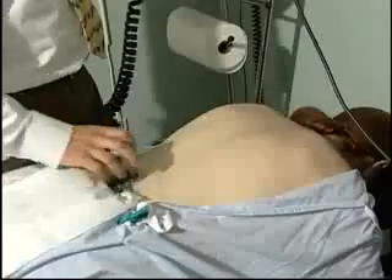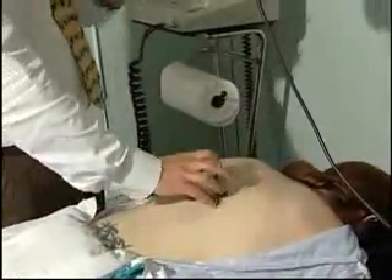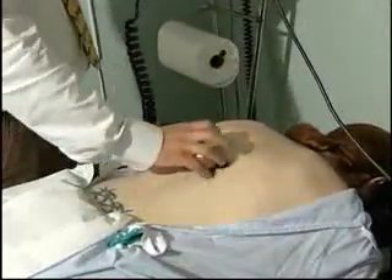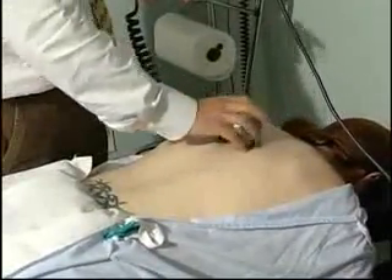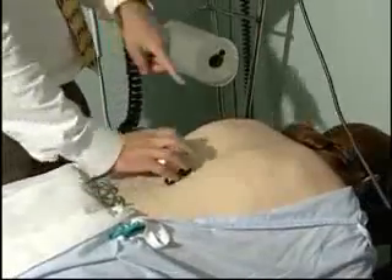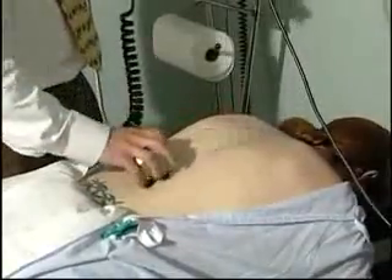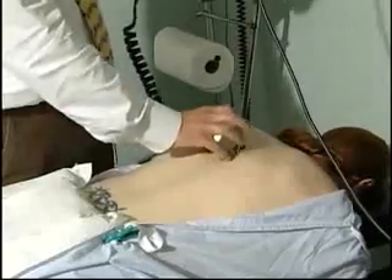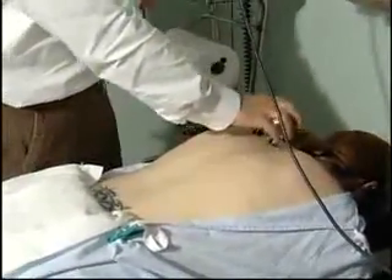The second portion is called the reflex. It's actually tapping on both sides of the spine — sometimes people feel a little ticklish in the beginning. Just like you do the knee reflex with a hammer and your knee kicks out, in your back you have little reflexes too. With chronic back pain, you start to lose muscle bulk right along your spine. This taps those muscles and wakes them back up — the muscles that support and stabilize your spine.